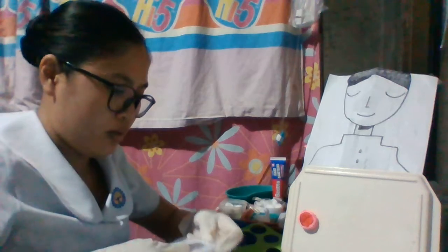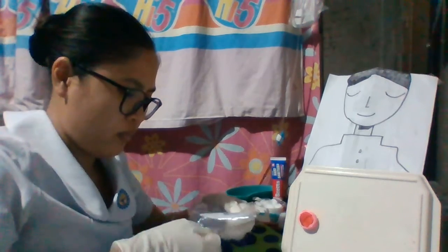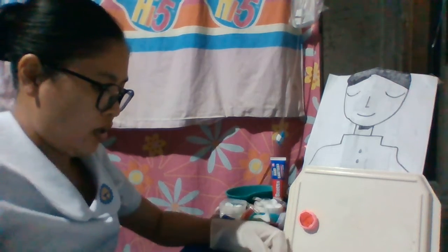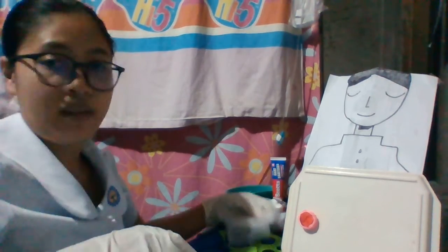Then after cutting this, we're going to place it on the bedside for the meantime.